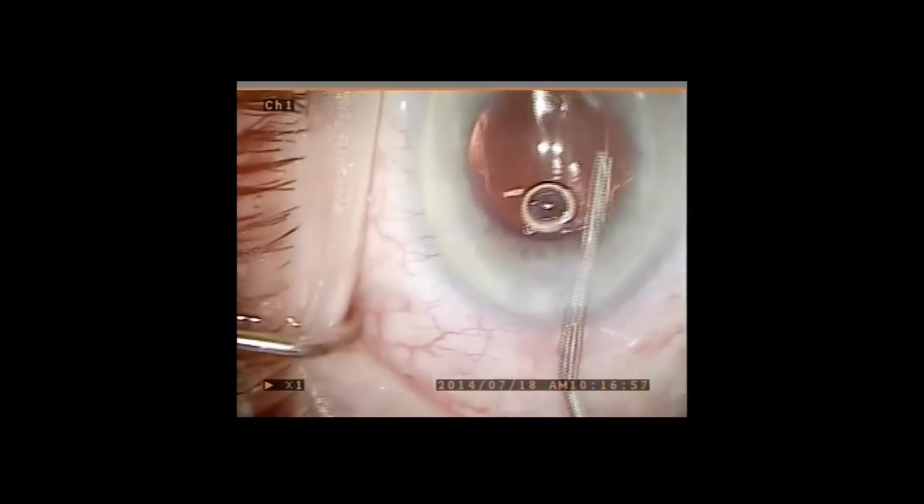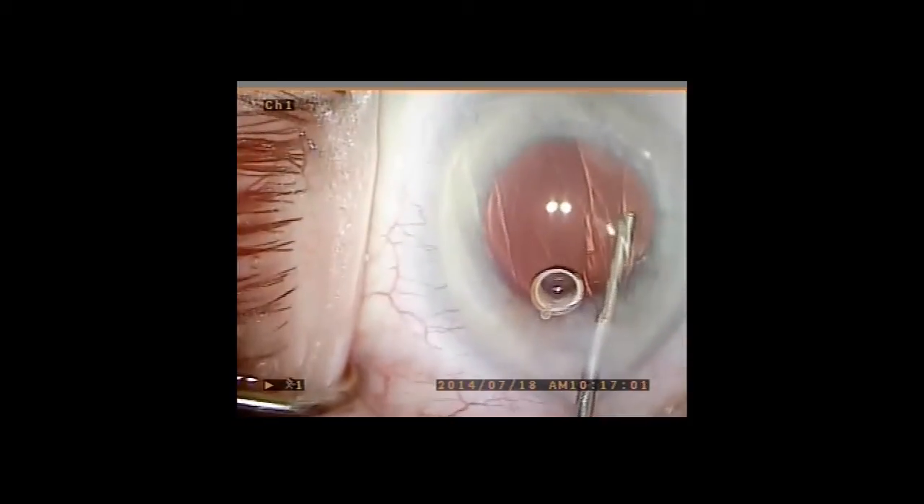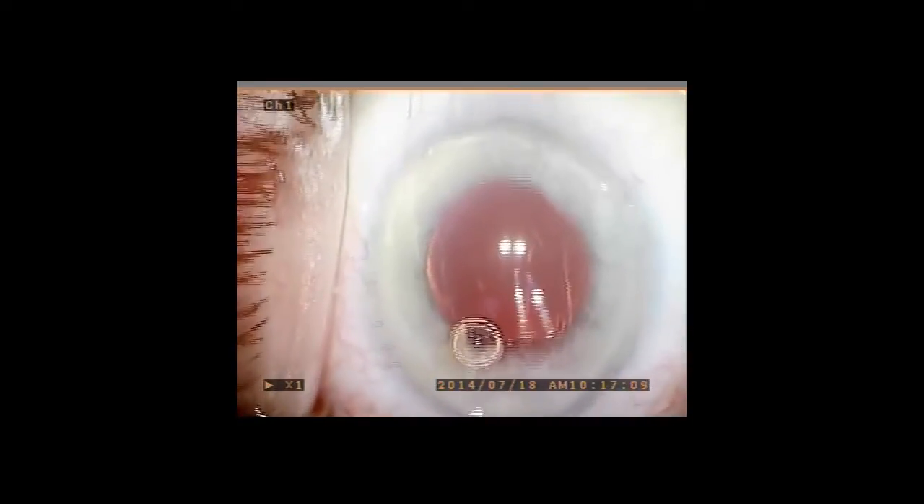In this video, a one-piece AMO Tecnus multifocal lens has been placed in the capsular bag. Viscoelastic is used to expand the ciliary sulcus until the anterior capsule edge is visible.